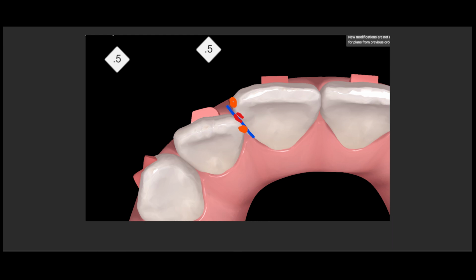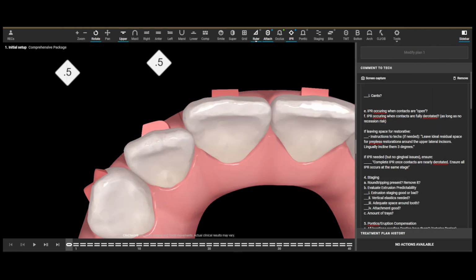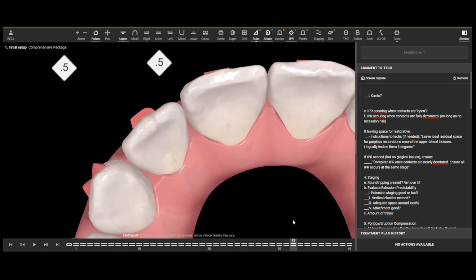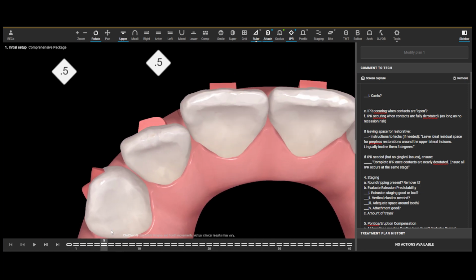And it can result in the teeth looking very, very funny if you're doing the IPR on the buccal of a tooth and the lingual of another tooth. So in very few circumstances do we do IPR when there's crowding between teeth. Instead, we'll almost always derotate the teeth first, and then the IPR can occur once the teeth have moved into a proper position.